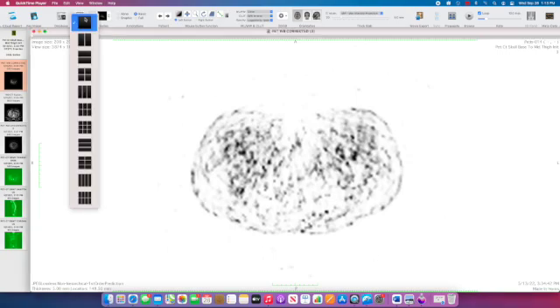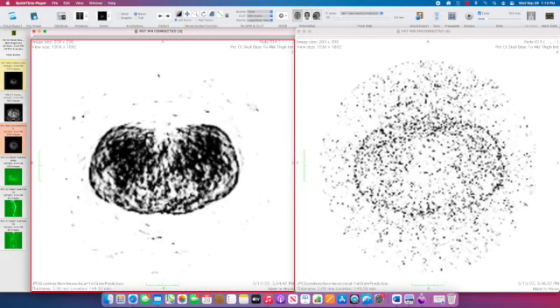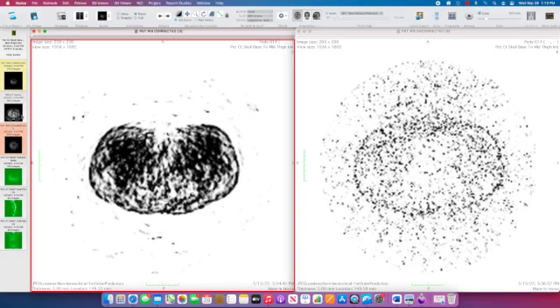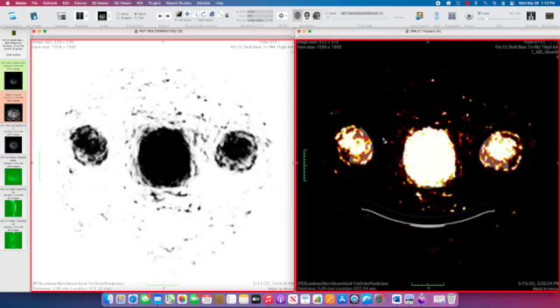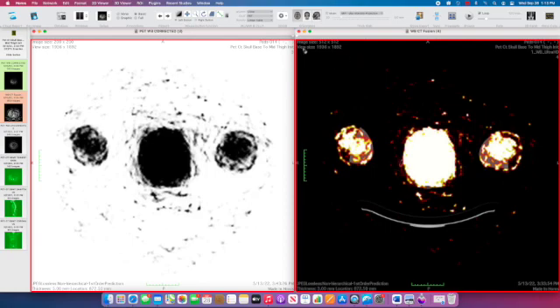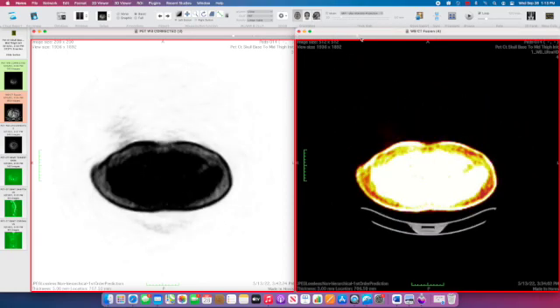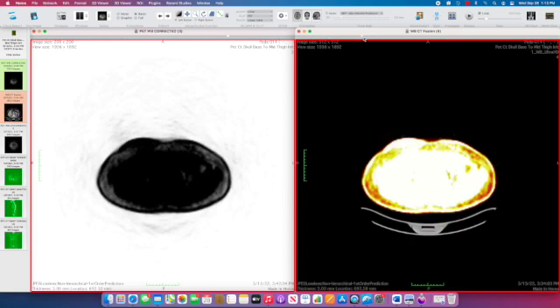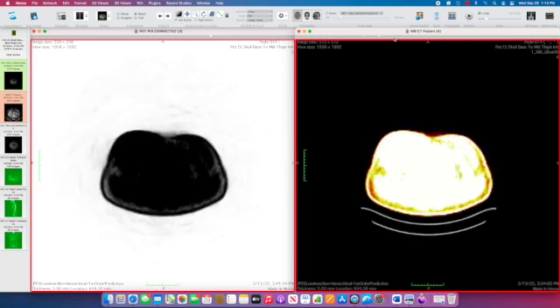I'm going to change to two windows. I want one window to show PET corrected data and another window to show the CT images. The software will fuse them, but the windowing of the PET is too intense—can't really see anything.